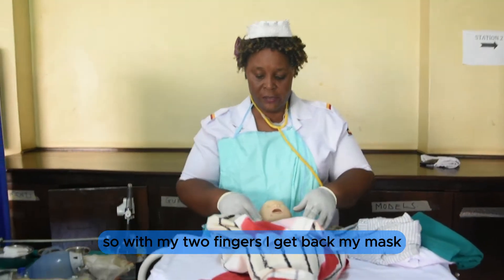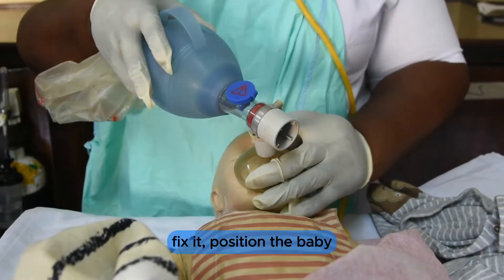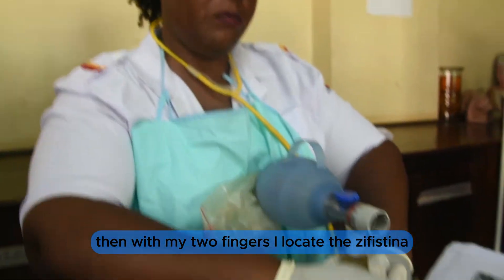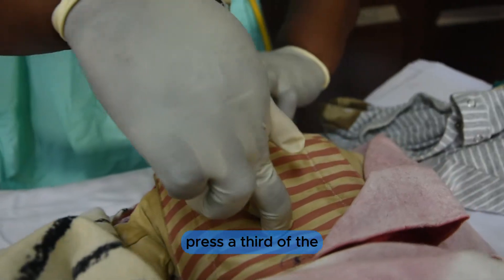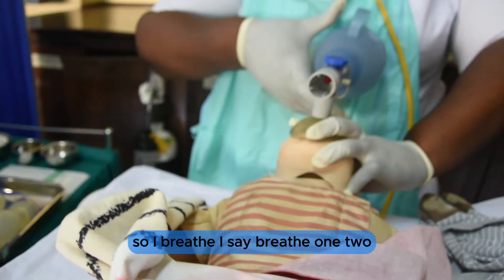With my two fingers, I get back my mask, fix it, and position the baby. With my two fingers I locate the xiphisternum, and from the xiphisternum I press a third of the chest. I coordinate compressions with breaths, counting: one, two — breathe — repeating this cycle for one minute.